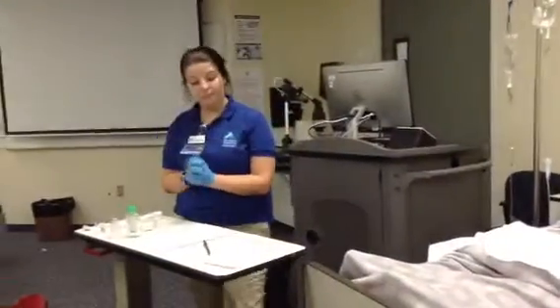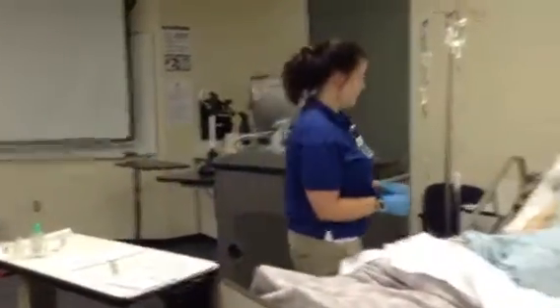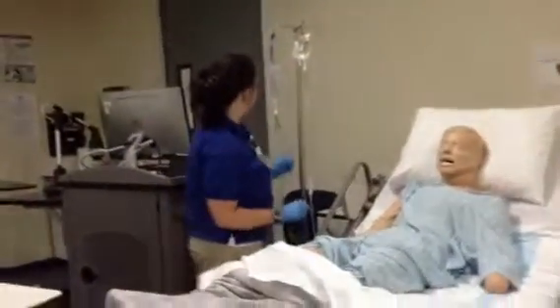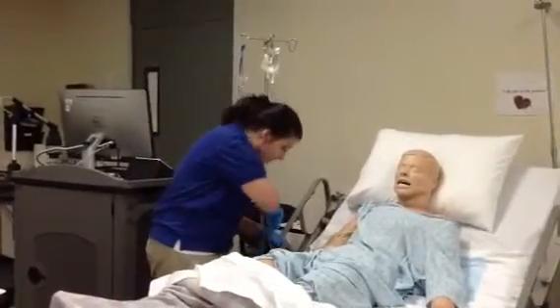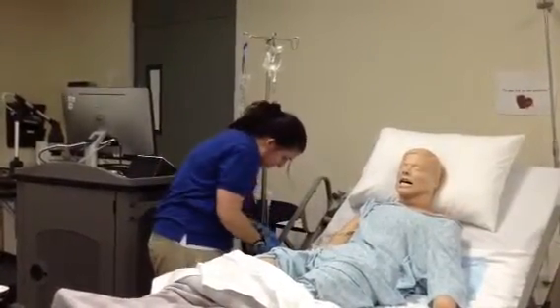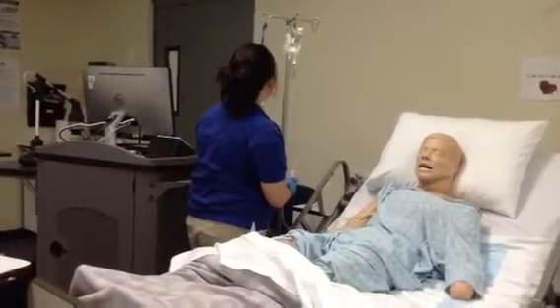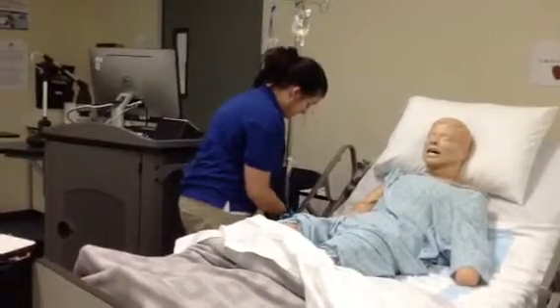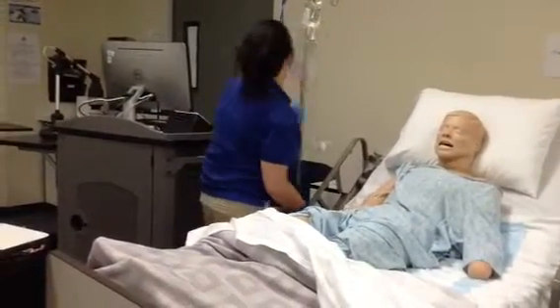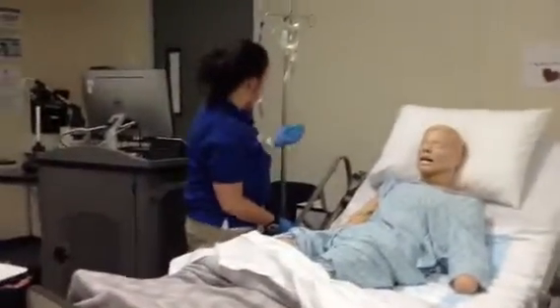Okay. Alright, so now let me go ahead and grab this. Okay, and that's all the way given. You're doing good. Okay, and the site still looks good. Alright, I'm going to go ahead and clamp this. Okay, clamped. Unhook this, and at this point I would make sure there was an alligator clamp for the next administration if anybody had to give one.